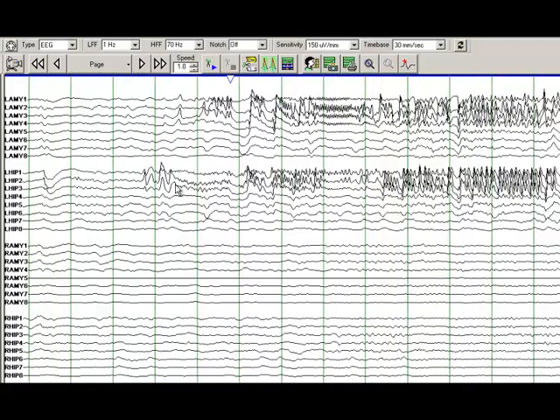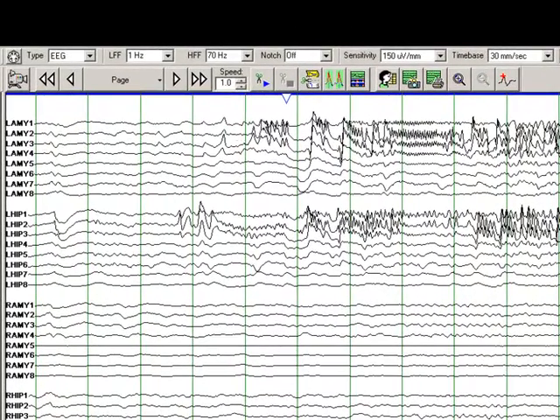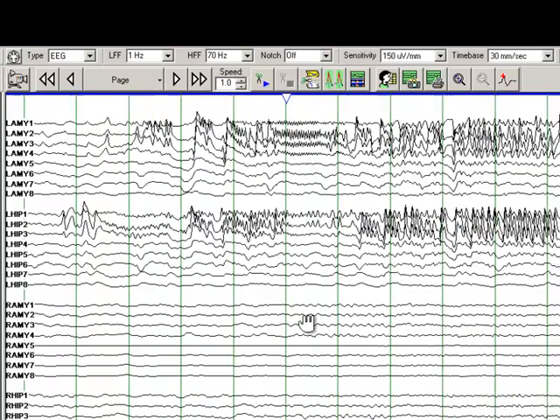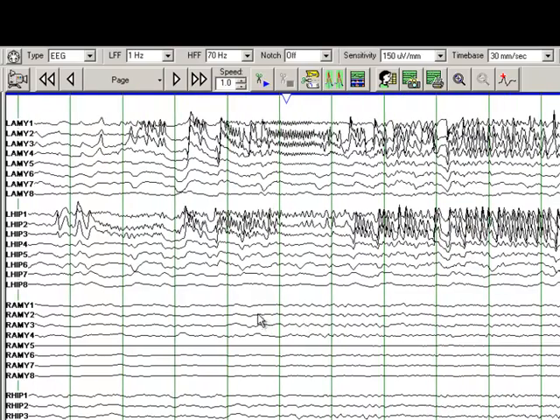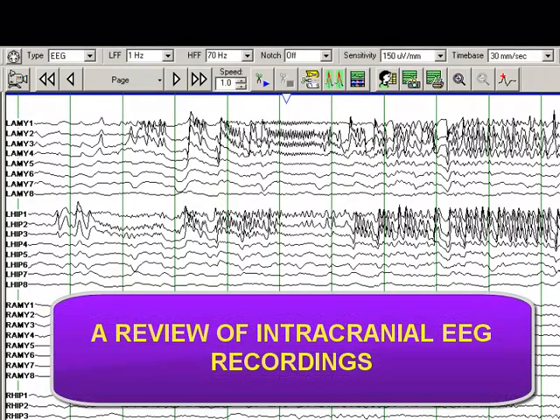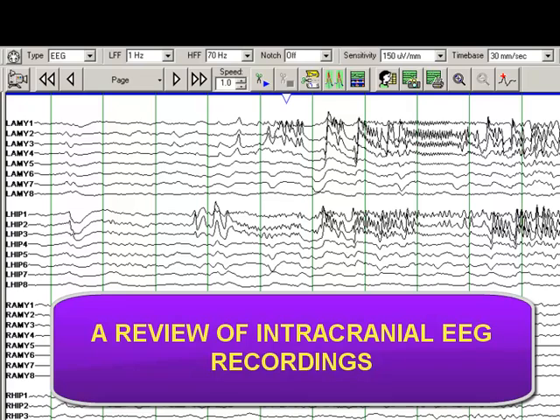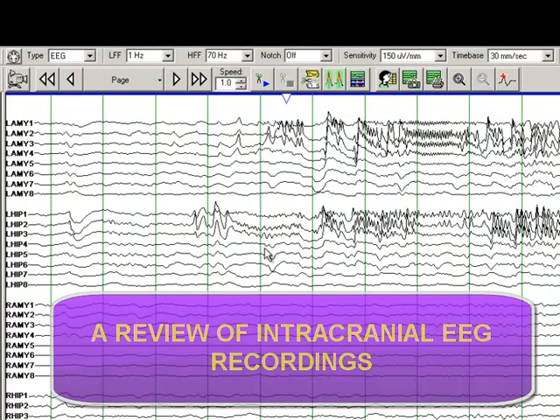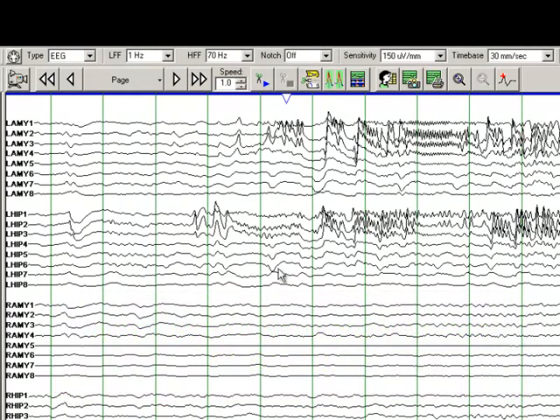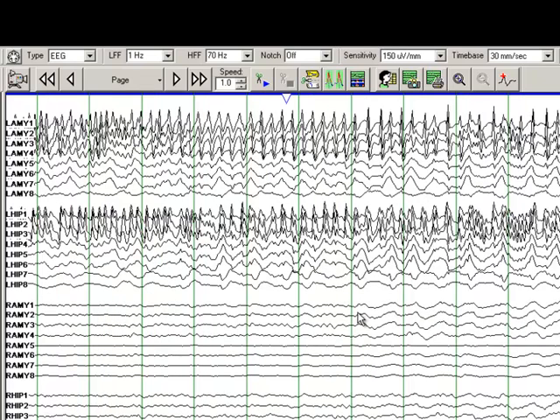And then very quickly, within a second, you start seeing involvement of the left amygdala, and this is how it continues. So the seizure, as we defined the seizure, it has a clear beginning. So you have seen the clear beginning. It has a clear end, as I will show you, and it has evolution in frequencies in amplitude and frequency. So evolution in frequency and amplitude is a feature of electrographic seizures. And you can see the very clear change in frequency and amplitude.